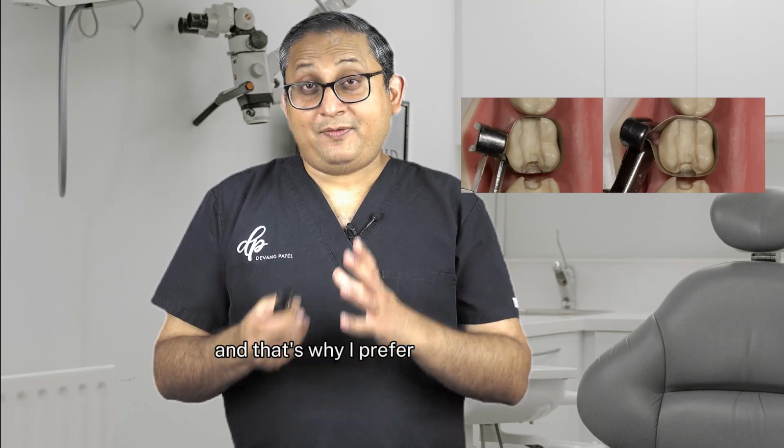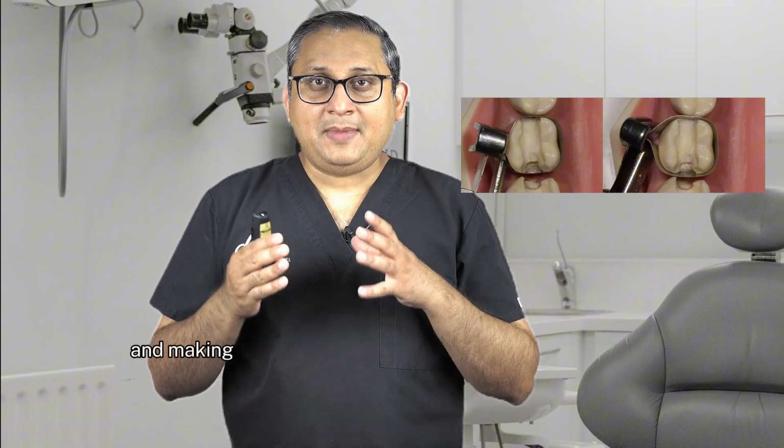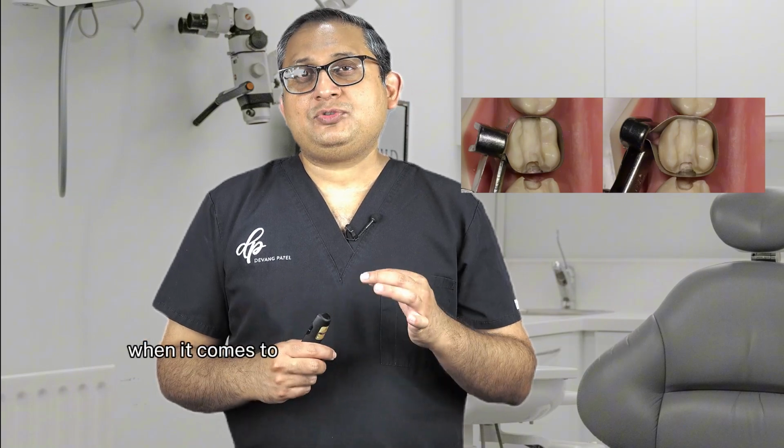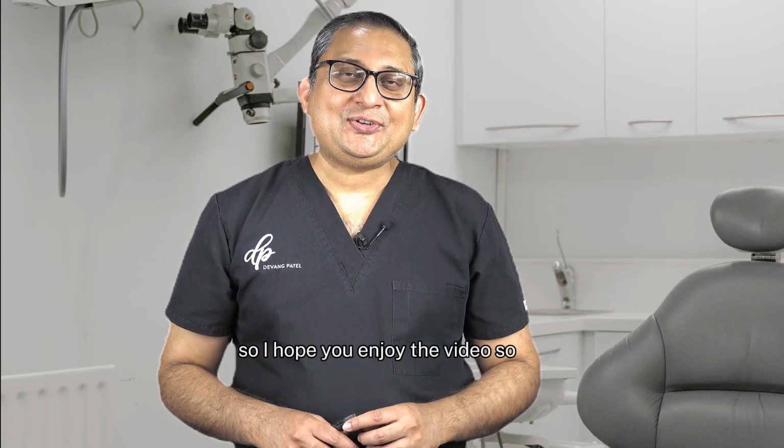And that's why I prefer this band system, and that's why I said selecting your matrix band system and making sure that you get this really nice seal is the key when it comes to restoring and doing deep margin elevation. So I hope you enjoyed the video so far.